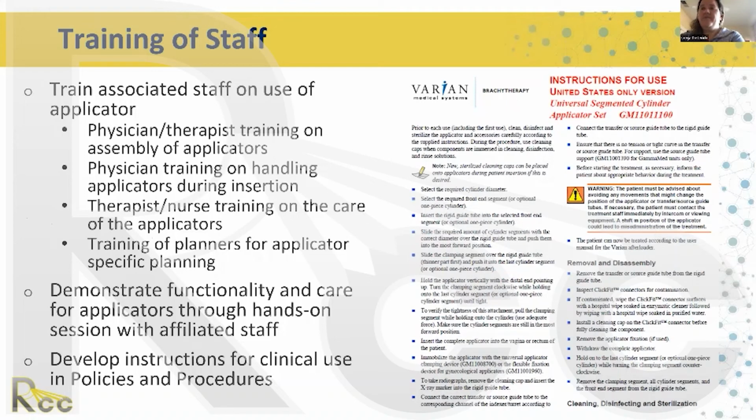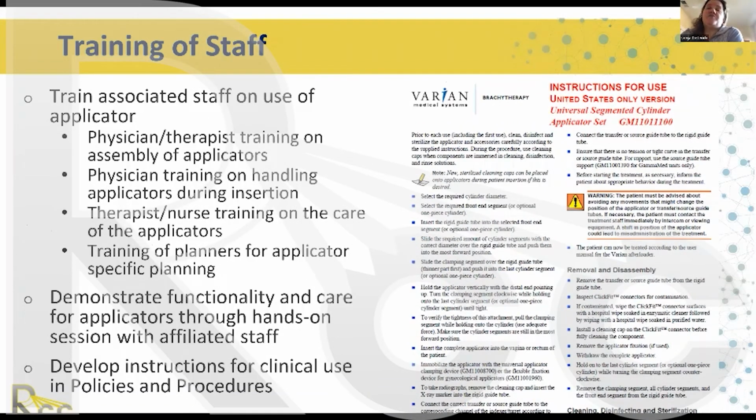Training. Very, very important. Train everyone on the use of applicators. And I talked about this physician who forgot a part of his training and put undue load on a fragile part of the applicator and actually broke a couple very expensive applicators. So train your physicians and therapists, anybody who handles the applicators, on how they get assembled correctly, which order, where to put pressure, where to avoid putting pressure.